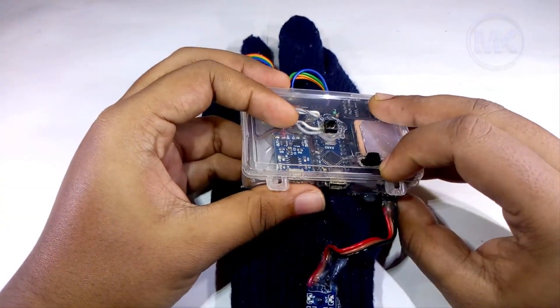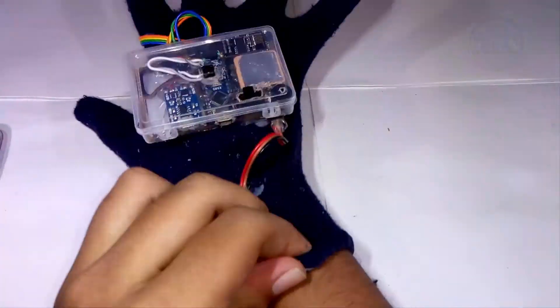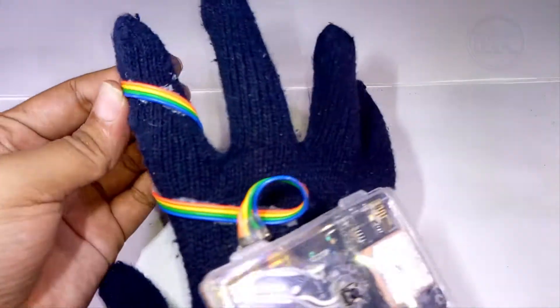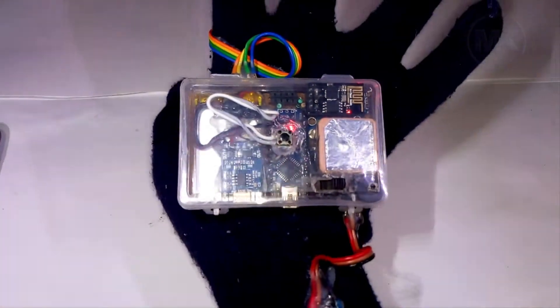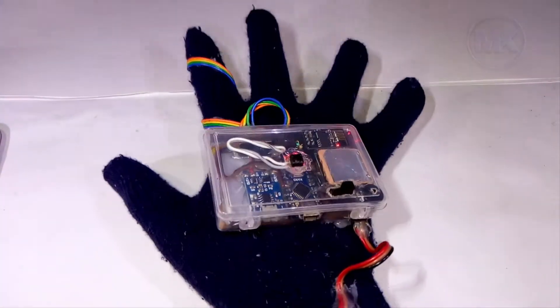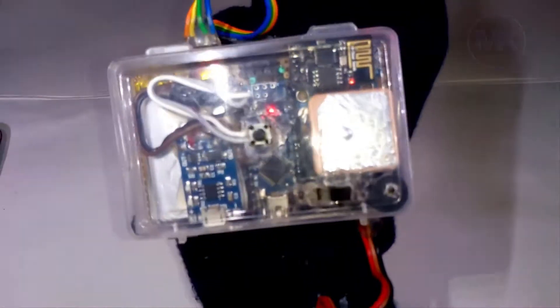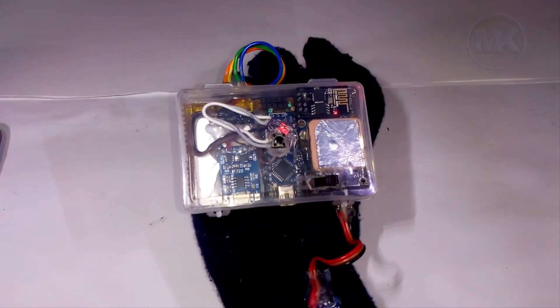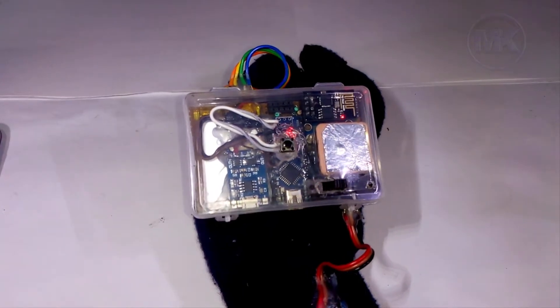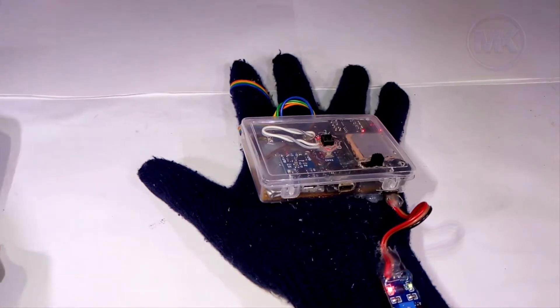Let's see how this glove works in real time. I have worn this glove on my hand and now I am going to switch on the circuit. As you can see, the green LED is blinking as well as the buzzer is making some sounds — whenever it detects a heartbeat, it generates a beeping sound.